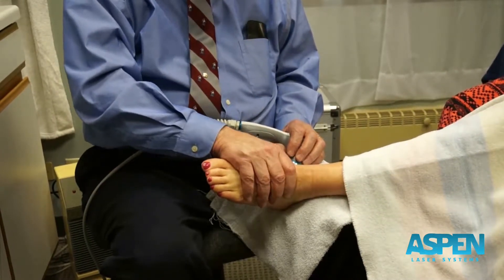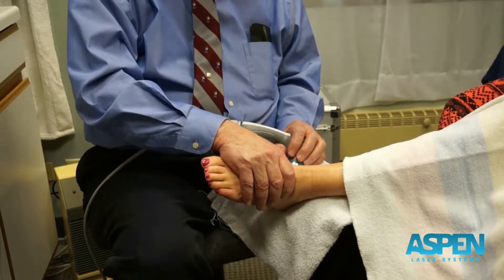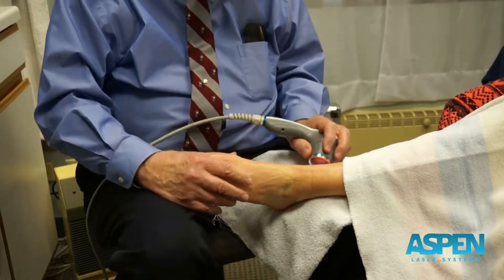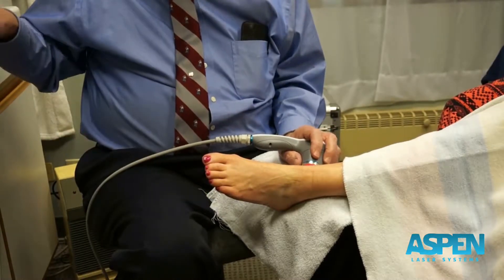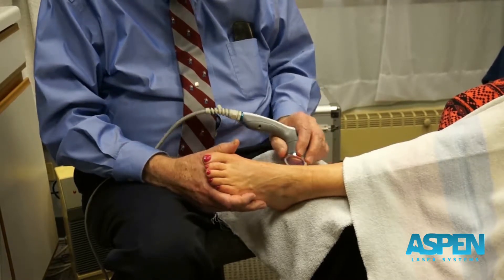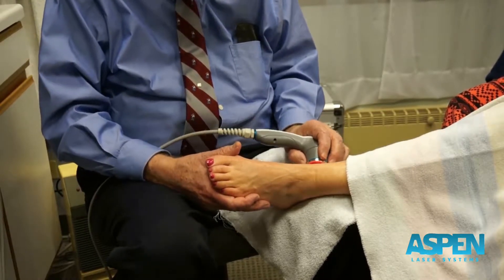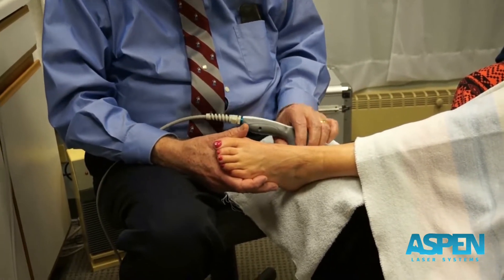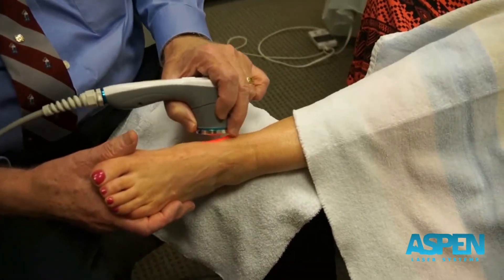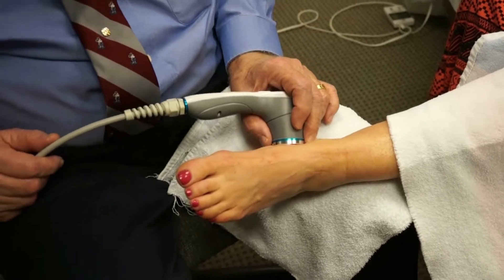Now sometimes, since I've got the medial side over here, the deltoid ligament right under here, sometimes I'll be right on it, I may be a little bit off of it — superior, inferior, that kind of thing. So therapy, turn the unit on. Because of the bones etc., it's a little rough to do that continual contact motion, so a lot of times I'll just drag my finger off the skin just a little bit — about a quarter inch off — and that way it makes it work a little bit better.